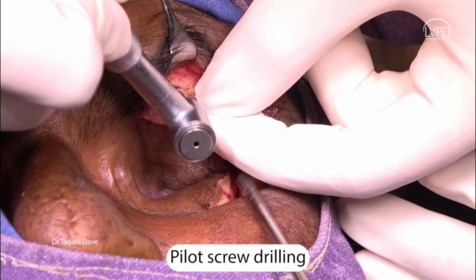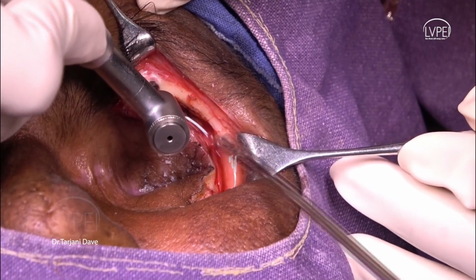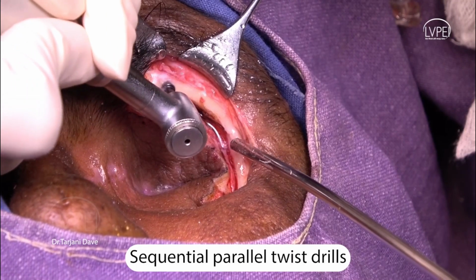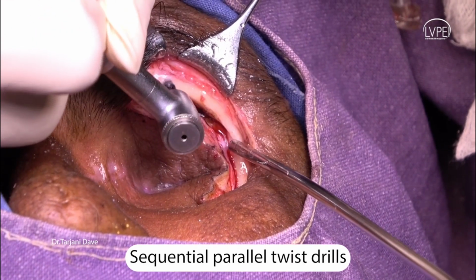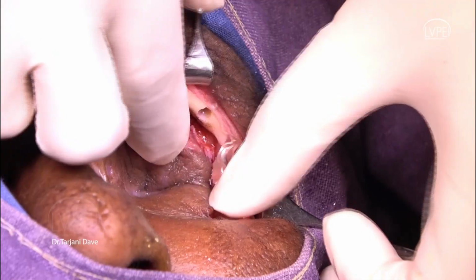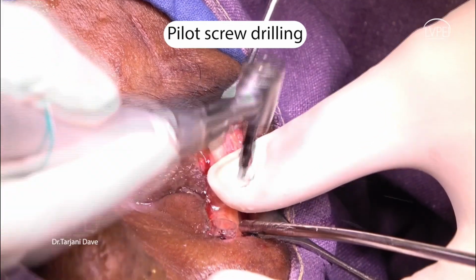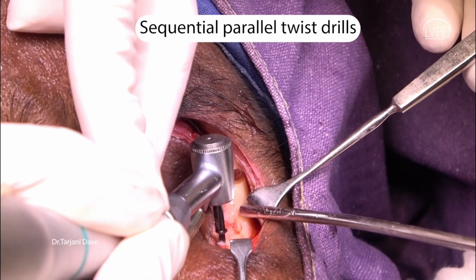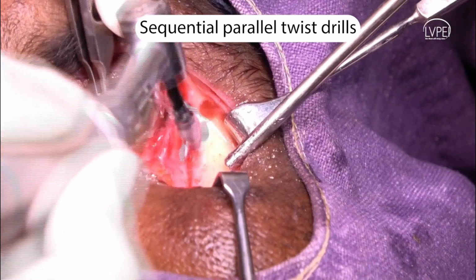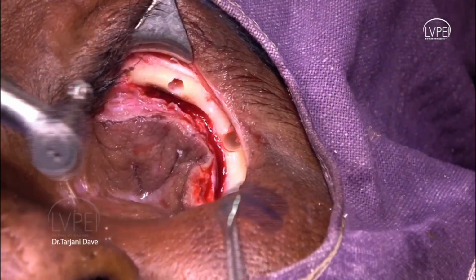Bone template is placed on the bone to help orient the direction of drilling. Pilot holes are drilled, followed by sequential parallel twist drills, in order to widen and deepen the osteotomy hole to the required size. Bone drilling is done perpendicular to the bone as it will affect the trajectory of the implant. Also, copious irrigation is given during drilling to avoid thermal bone injury that can affect the osseointegration process.